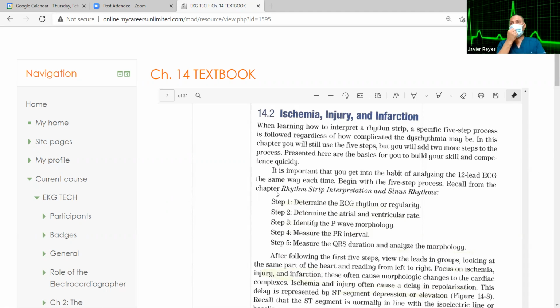Of course, also with an EKG. An EKG tells you also when you have a deep Q wave, but no ST elevation, just a deep Q wave, no ST elevation. They call it an infarct of undetermined age. That means you had one a long time ago, somewhere, at some point.